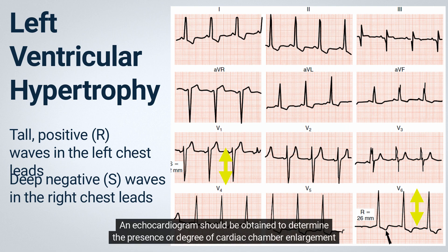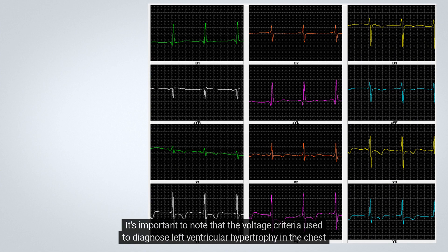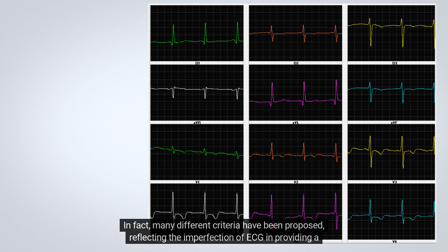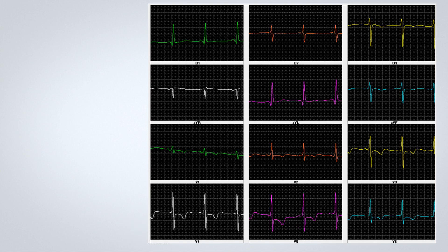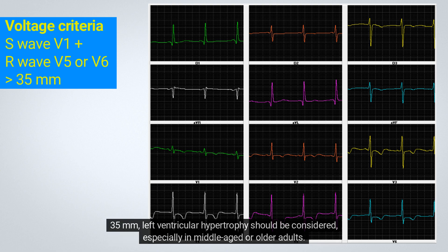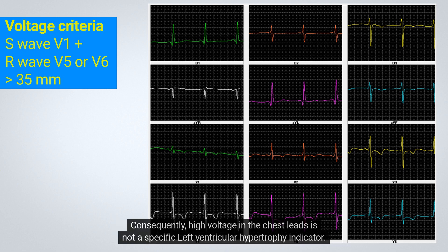An echocardiogram should be obtained to determine the presence or degree of cardiac chamber enlargement when necessary. It's important to note that the voltage criteria used to diagnose left ventricular hypertrophy in the chest and limb leads are by no means absolute numbers. In fact, many different criteria have been proposed, reflecting the imperfection of ECG in providing a test with both high sensitivity and specificity. If the sum of the depth of the S-wave in lead V1 and the height of the R-wave in either lead V5 or V6 exceeds 35 mm, left ventricular hypertrophy should be considered, especially in middle-aged or older adults. However, high voltage in the chest leads is a common normal finding, particularly in athletic or thin young adults, and consequently is not a specific left ventricular hypertrophy indicator.